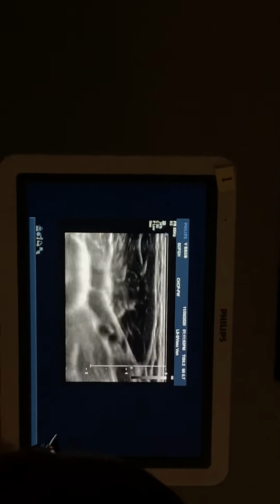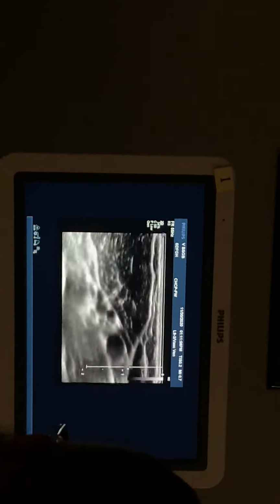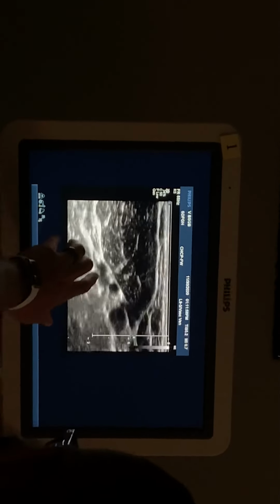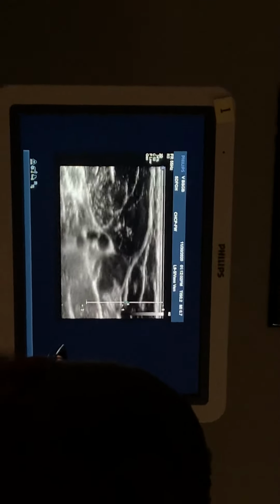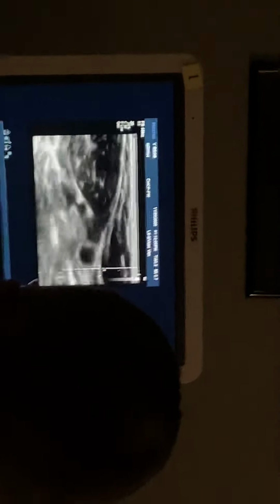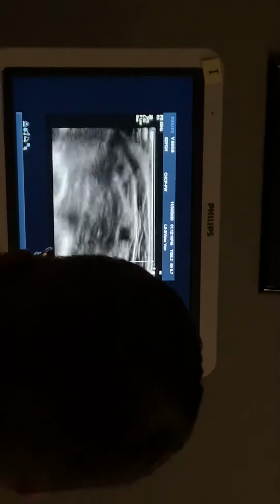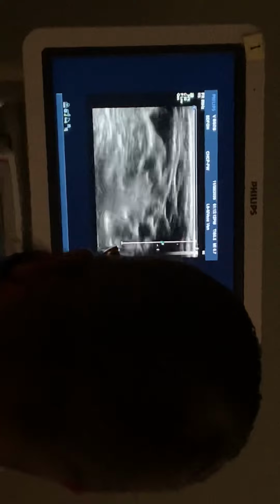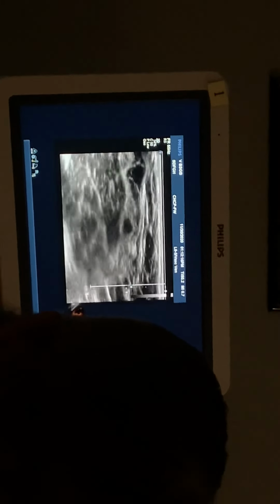Now we're going to come to the brachials. See, her brachials are paired. But watch right here. There's three. They split, and then those two go back together. See that? That's cool. So all the way down at the elbow. Without and with compression.